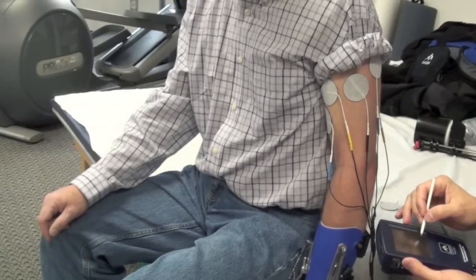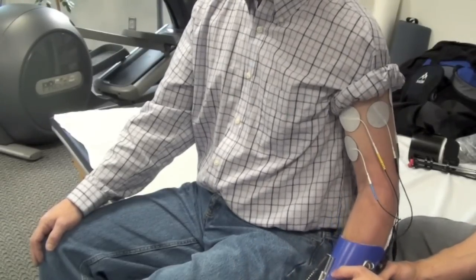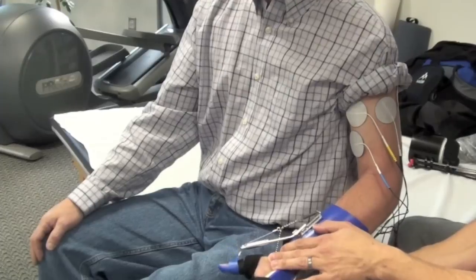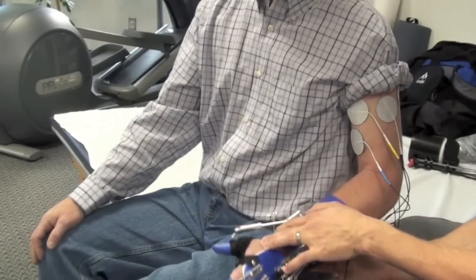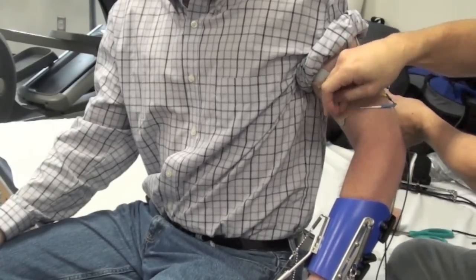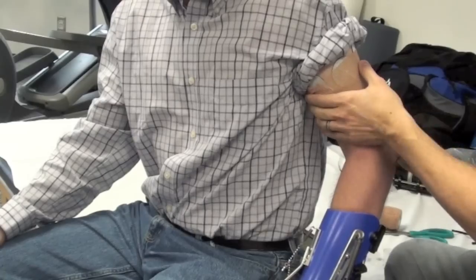To confirm proper EMG electrode placement, turn on the device and select the EMG assessment mode and have the patient repeatedly bend the elbow to fire the muscles. If you see a good quality signal for the biceps, then the placement should be sufficient. To minimize electrode migration, consider using Coban wrap or something similar before applying the above elbow cuff.